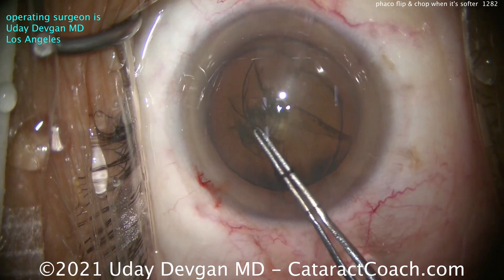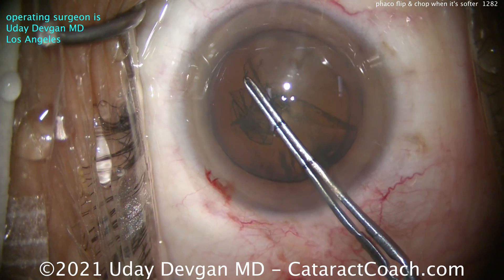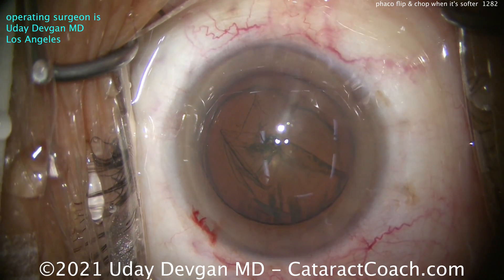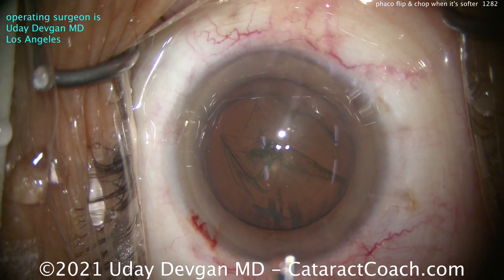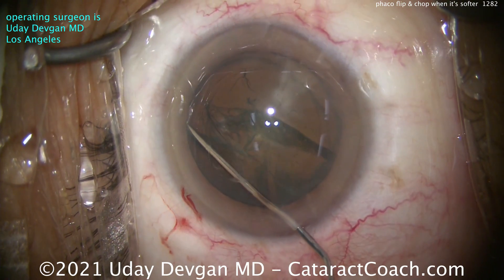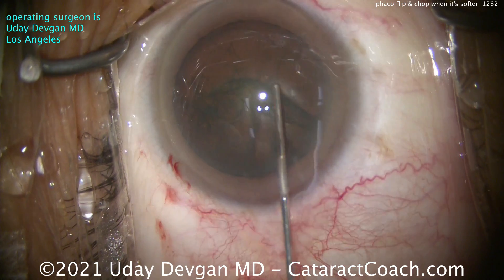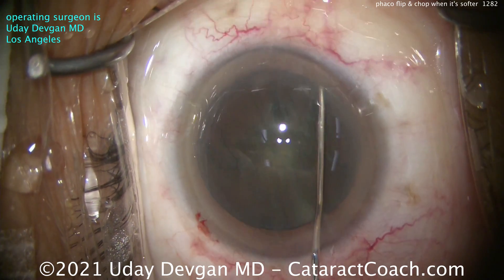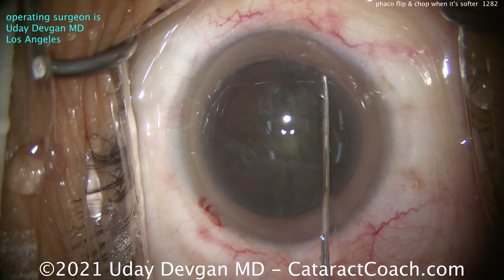Notice how we pivot in the incision and get that as round as we can — we take pride in that. Looks great. Here's the secret of the whole case: BSS on a cannula, slow and steady on the hydrodissection. Once you see the first wave, don't stop. Go to the other side, get another wave, then another wave. We want to keep doing it until we get the nucleus to prolapse up out of the bag.